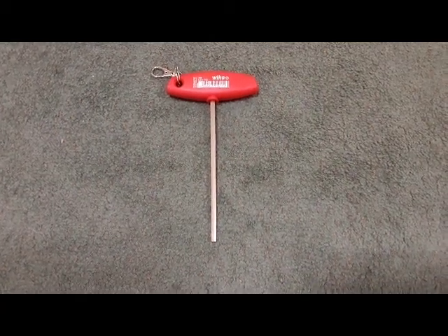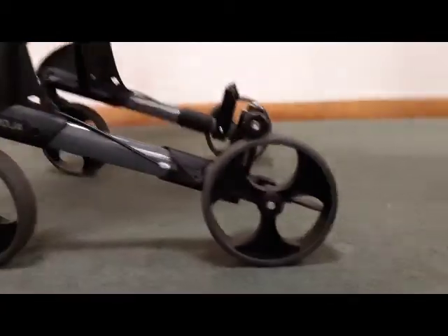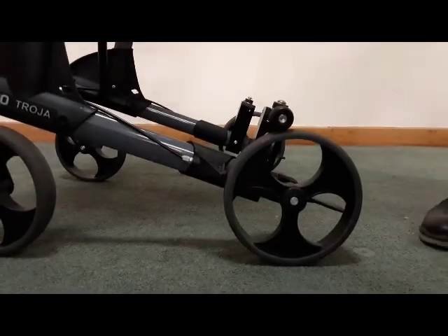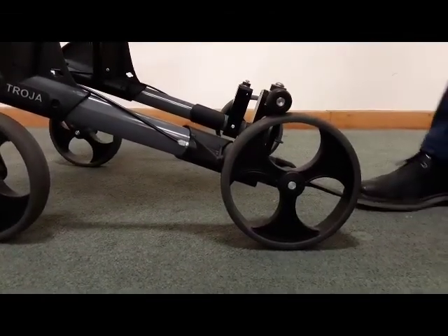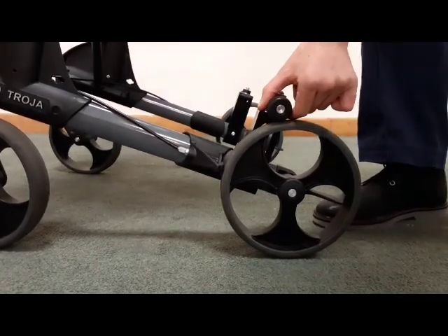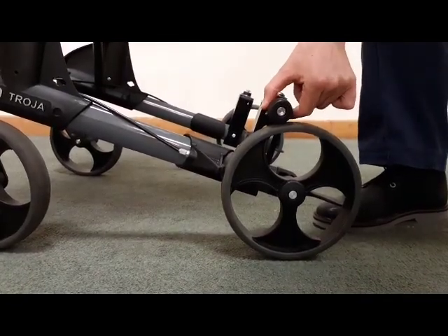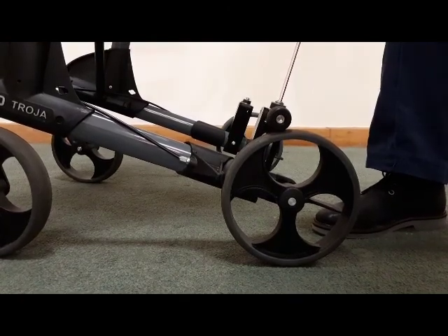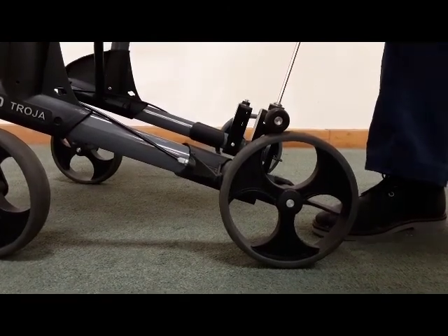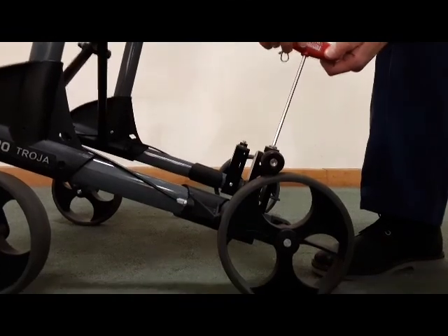Using the 5mm Allen key, adjust the drag brake of the rollator. Set the top of the drag brake small black wheel so it just touches the larger wheel. Place the Allen key into the top of the bolt and turn clockwise to increase the tension.